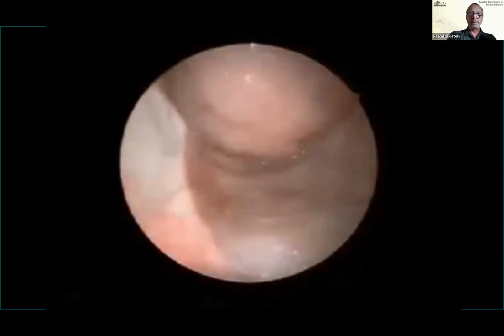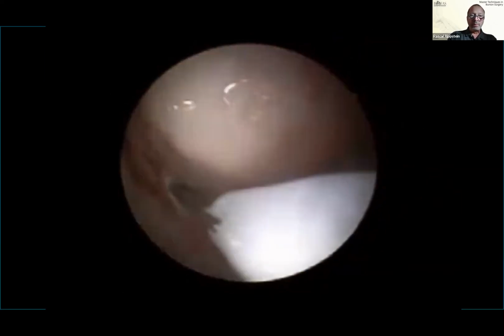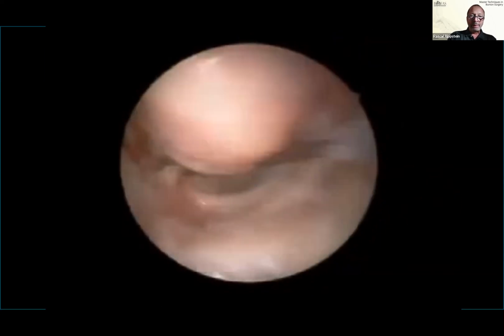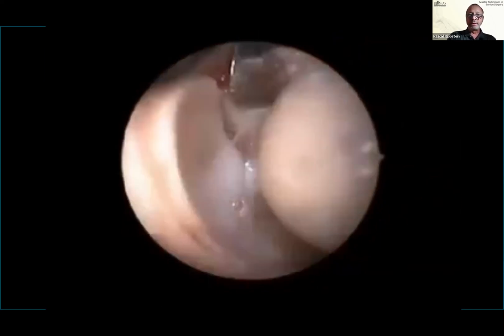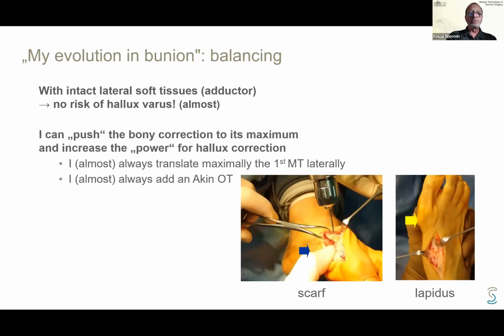That's a small arthroscopy. You can see the Beaver blade just over, that's the head on the top, and underneath you see the lateral sesamoid, and the blade is just going through the capsule right over the sesamoid, opening the door, allowing the reduction of the head over the sesamoid. Now, the advantage of leaving the stabilizing structure on the lateral side, meaning the adductor, was that the risk of hallux varus was clearly reduced. And this allowed me to push the correction to its maximum.